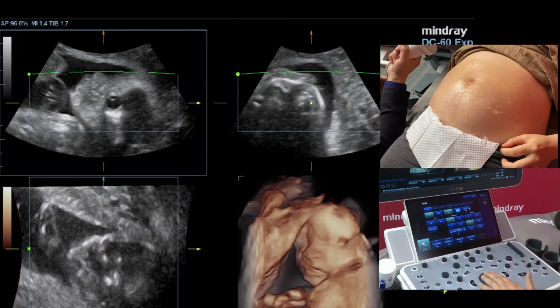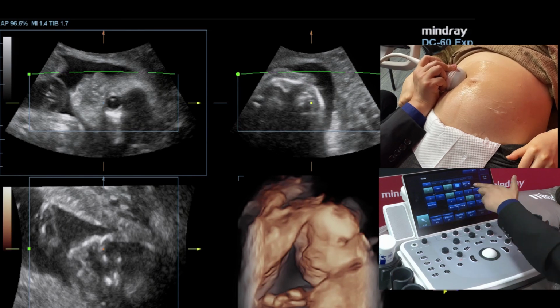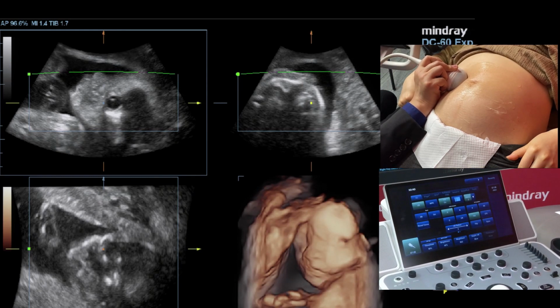Now also, if you don't want to change many things and get a good image, for this DC-60 ultrasound system, we have smart face. Just click this smart face, and then it will help you to remove many things in front of the baby's face and give you a better image.